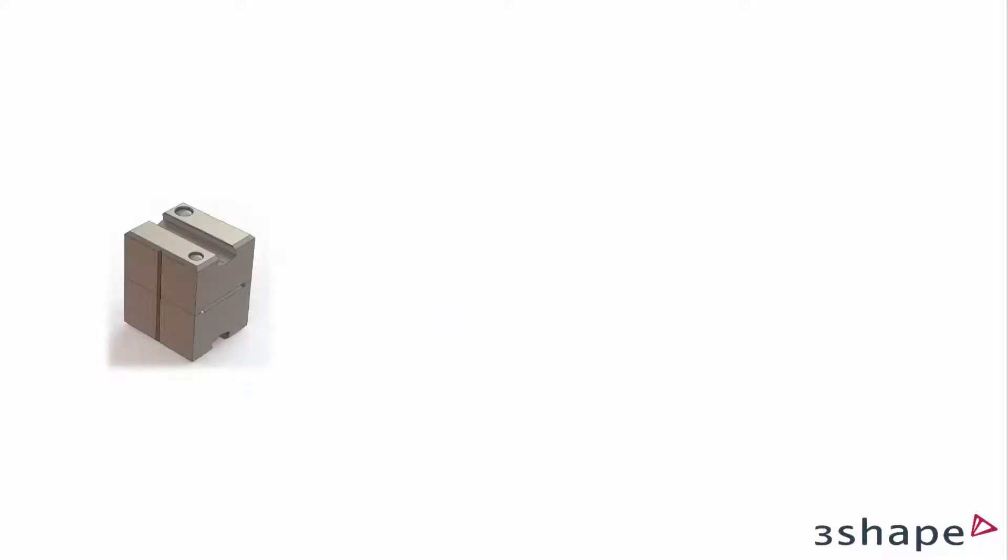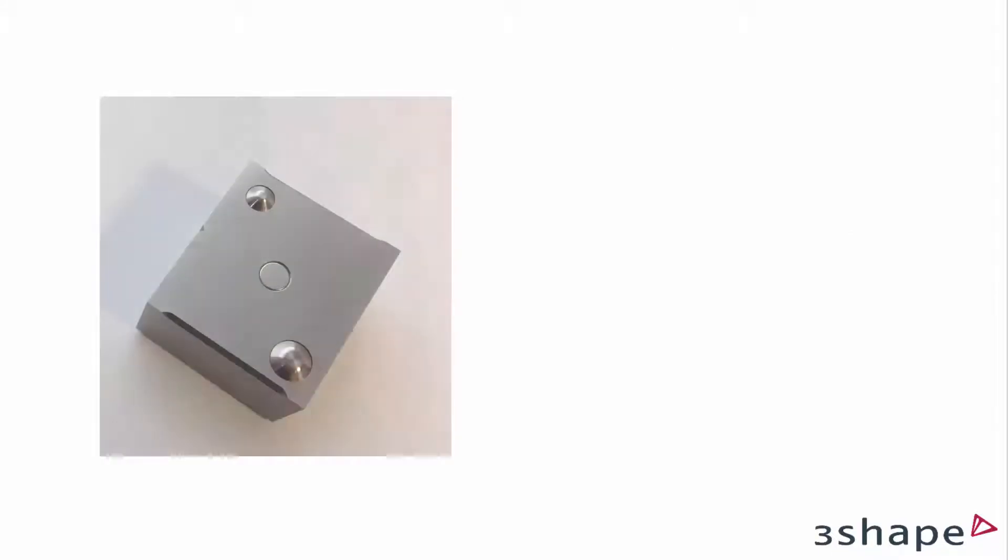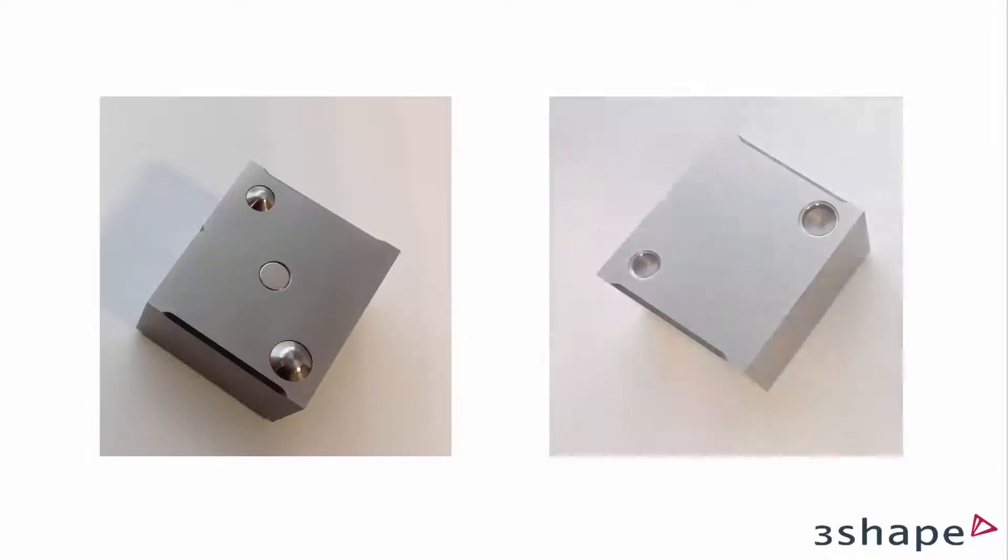The Occlusal Transfer Calibration object consists of two parts: the upper with two convex spots and the lower with two corresponding indentations.